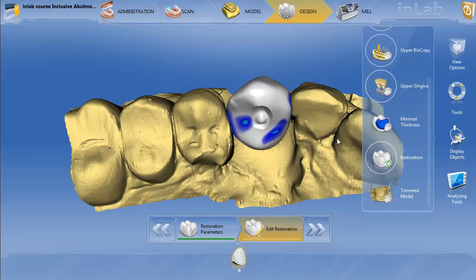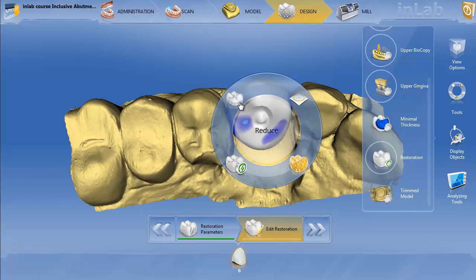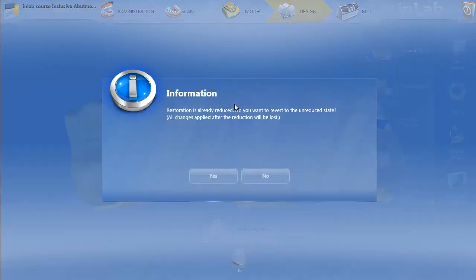You can see here that I have a screw axis hole made — it was made by the reduction tool. So if I want to get rid of this, I simply have to right-click, bring up my tool wheel, and re-click on reduce. It's going to say the restoration is already reduced — do you want to revert back to the unreduced state? All changes will be lost. I'll go ahead and hit yes.